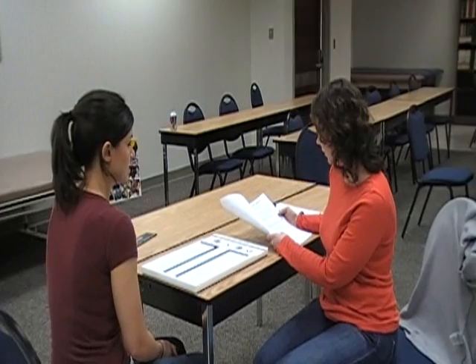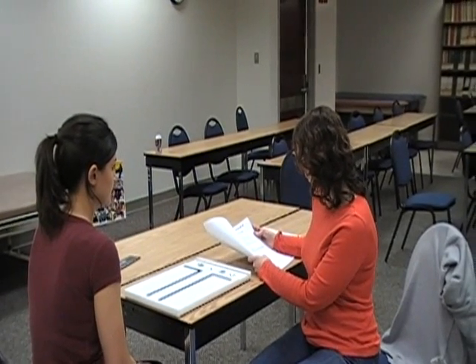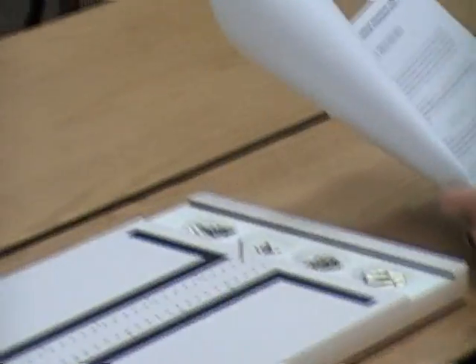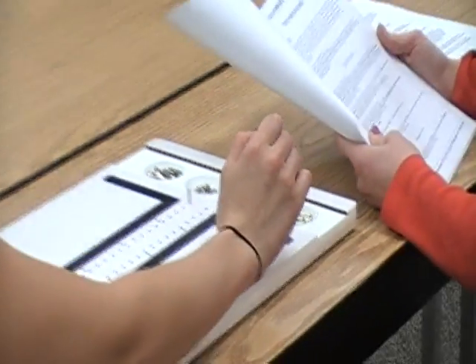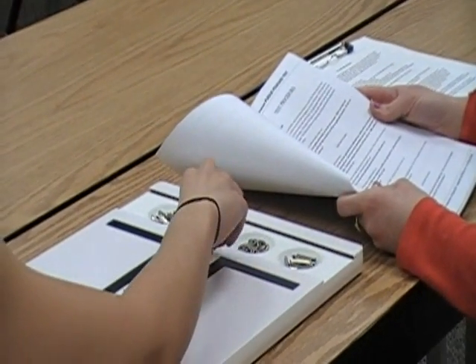To start the test, say: 'This is a test to see how quickly and accurately you can work with your hands. Before you begin each battery of the test, you will be told what to do and then you will have an opportunity to practice. Be sure you understand exactly what to do. For the right hand test, you have 30 seconds. Pick up one pin at a time with your right hand from the right-handed cup. Starting with the top hole, place each pin in the right-handed row. If during the test you drop a pin, do not stop to pick it up — simply continue by picking up another pin from the cup.' Then let them practice for three or four pins.